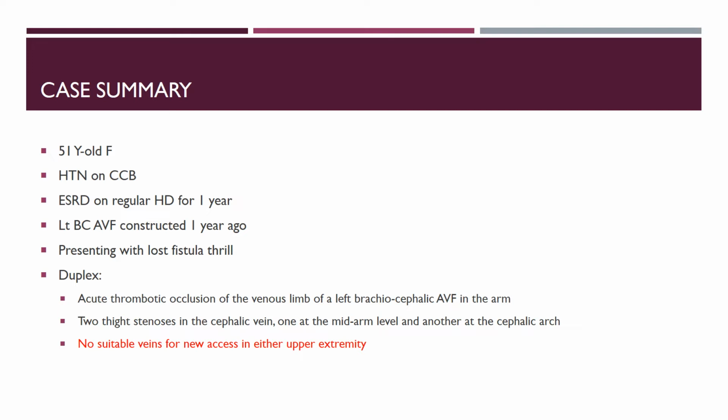End-stage renal disease on regular hemodialysis for 1 year. Left brachio-cephalic AV fistula constructed 1 year ago. Presenting with lost fistula thrill.